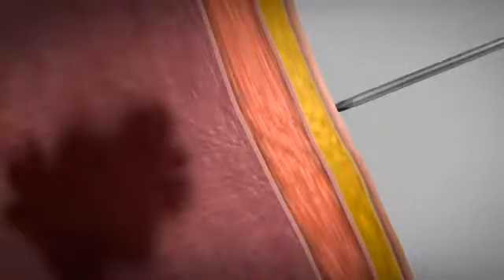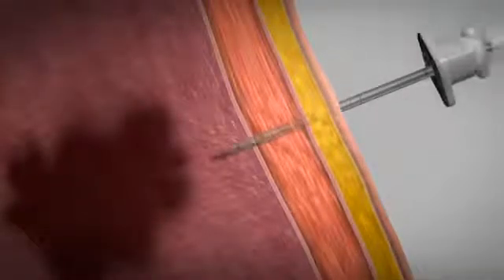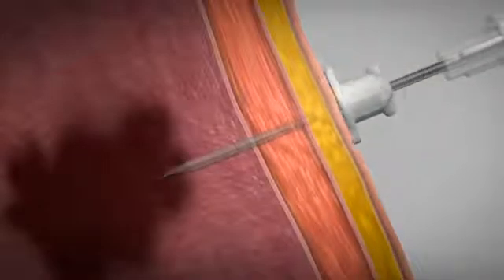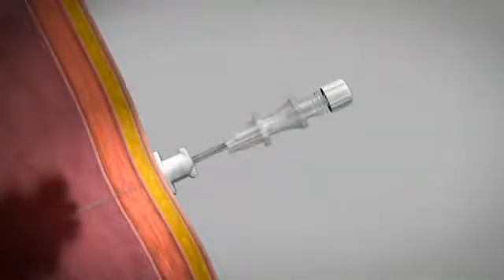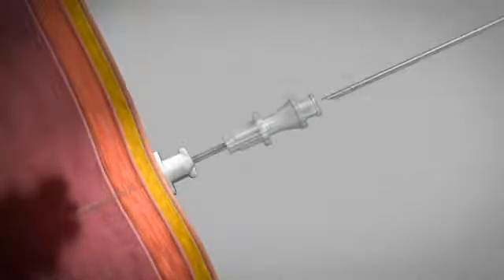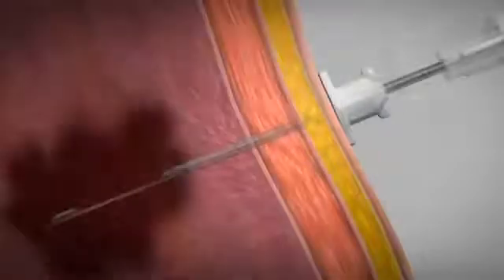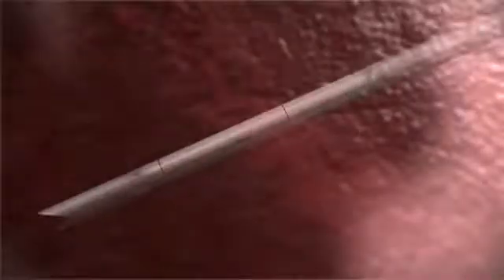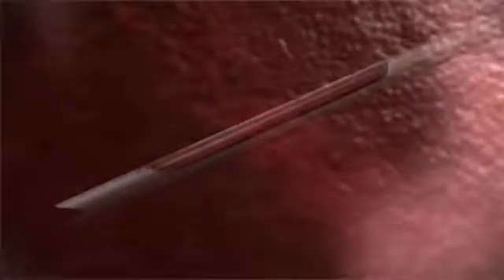The universal coaxial introducer features an adjustable skin stopper to control the depth of the coaxial needle tip. The coaxial introducer allows the clinician to take multiple tissue samples from the same site with only one percutaneous skin puncture, all with minimal damage to the surrounding tissue.